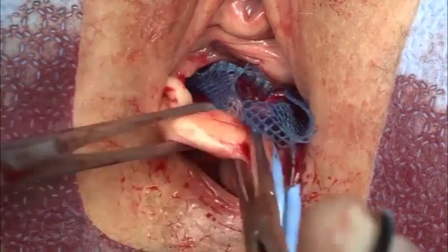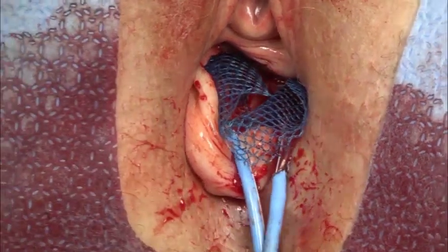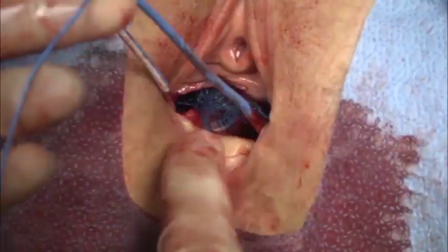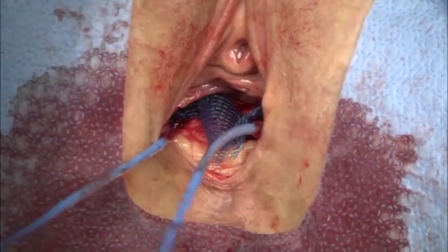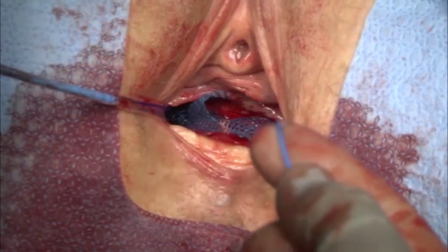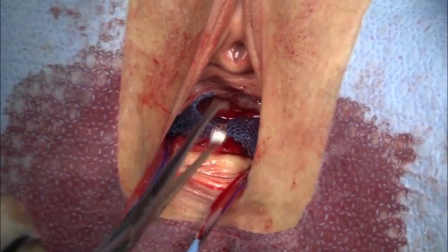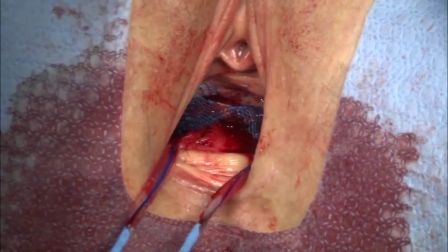To pull the mesh into the incision, activate the leg assemblies by pulling outwards. I often digitally elevate the cervix and vaginal apex to the level of the ischial spines, relieving tension on the apex as the arms are deployed. Take care not to over-tighten the mesh. Final adjustment is determined visually and also by palpation, as you will feel the mesh arms supporting the vaginal apex symmetrically to a level at or near the ischial spines.